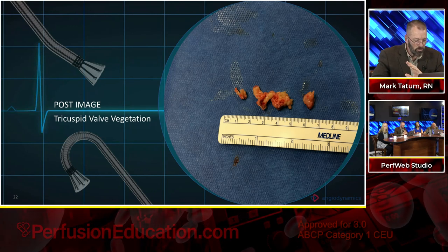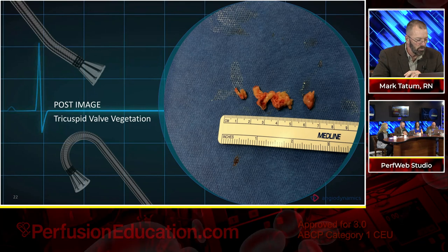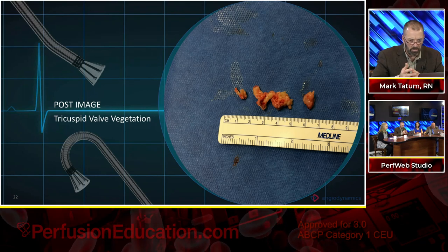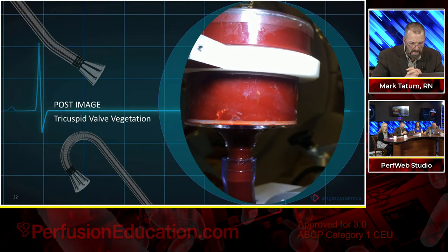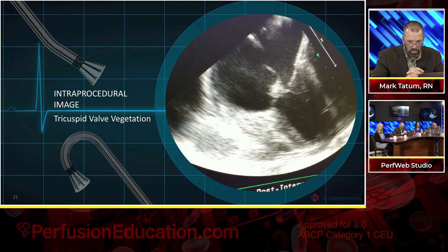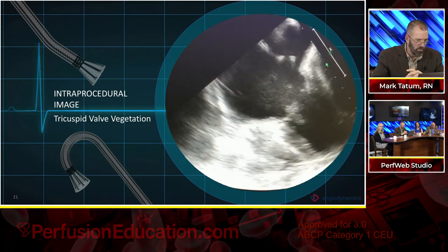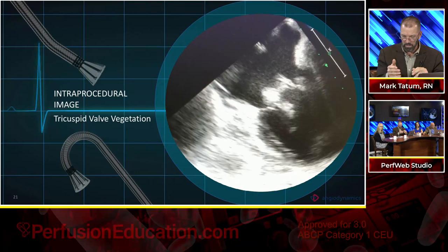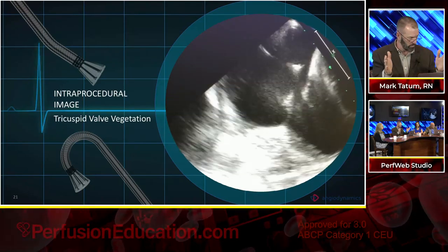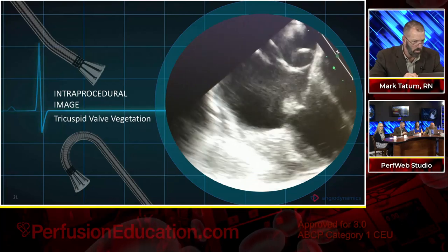And for the purposes of this, I would like to go back just a couple of slides. It may be slide 20. 21, that's it. Go ahead and click forward one time and let's see if it'll roll. Now you saw the vegetation that was sitting on the table there. The vegetation measured up to 4.5 centimeters. On this image, would you have guessed that you have 4.5 centimeters of material?